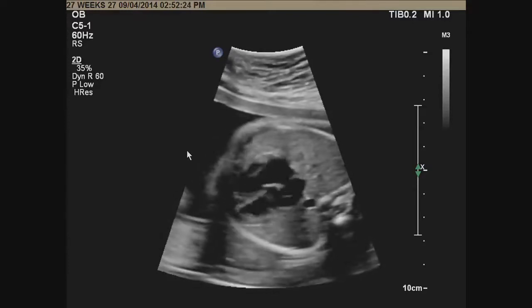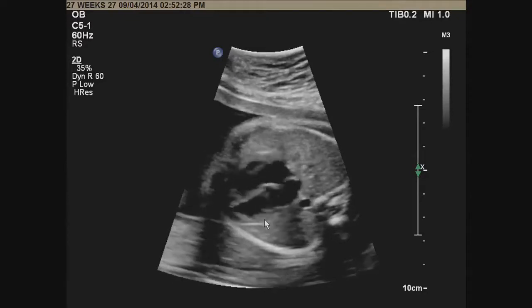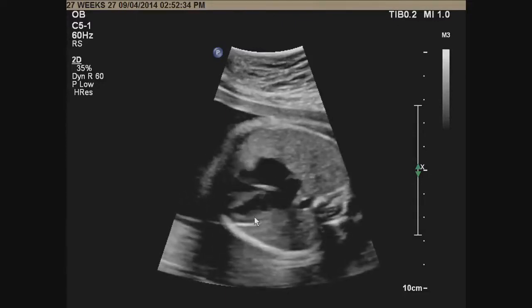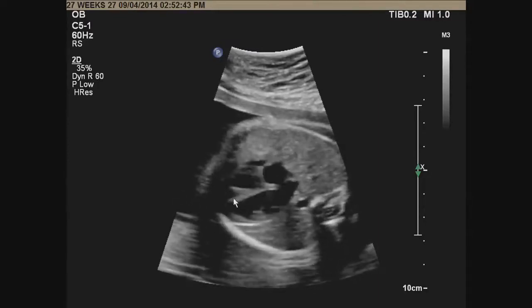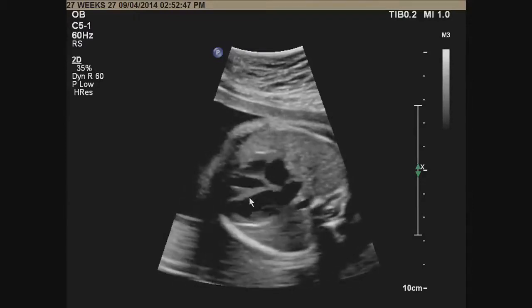And here this allows me to evaluate the ventricles, so I can look at the contractility. This is the left ventricle right here. Look at the apex. It forms the apex of the heart, nice and smooth on the inside, described as bullet-shaped. And you see the contractility is nice and equal. I also look at the septum to make sure there's no abnormal contractility of the septum. So the septum is moving nicely between the two.